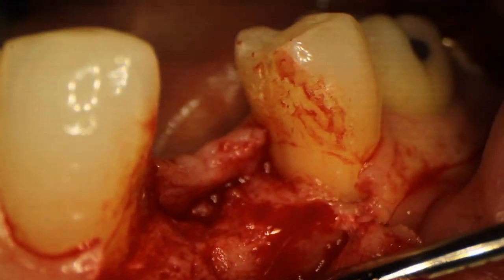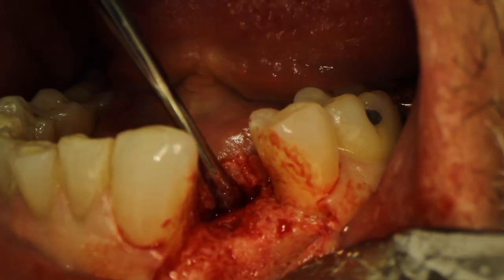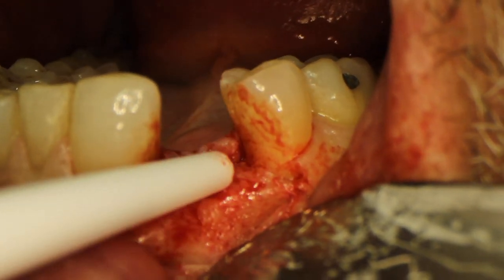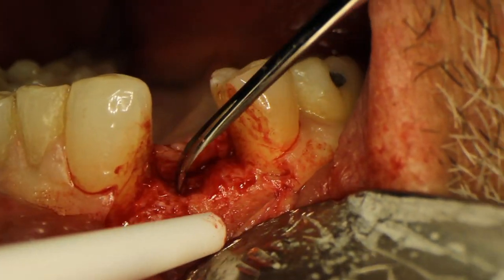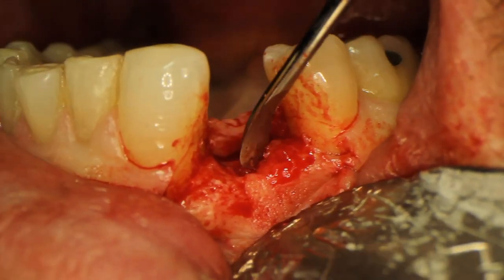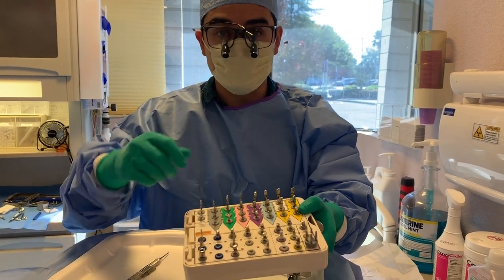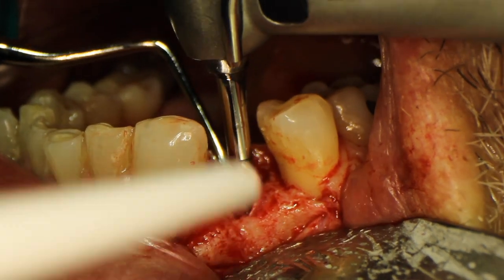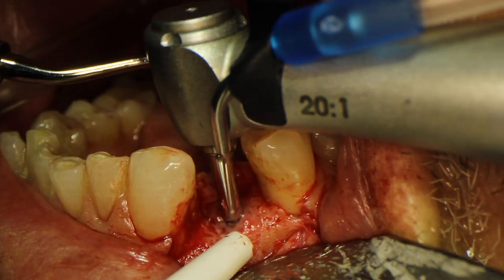Now I'm peeling back that flap a little bit more with the releasing incisions, and I'm going to slip my Minnesota retractor in there and get ready to use the pilot drill. I'm looking at the buccal wall and lingual wall to find the midpoint so I can place my pilot drill. There was a little bit of fibrous tissue there so I'm just scraping some of that off. For this case I'm actually using the Implant Direct Spectra kit — a kit that allows you to place a couple of their different implant types. I go down sequentially, and the first drill I'm using is their pilot drill. I actually prefer the Neodent pilot drill, but this one works fine. I go down about 6mm and evaluate my angulation.